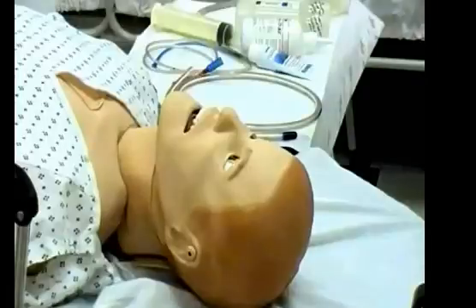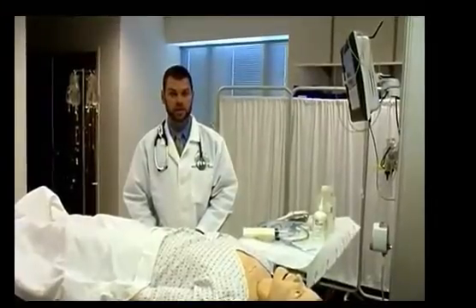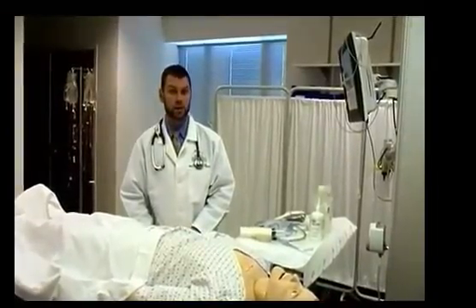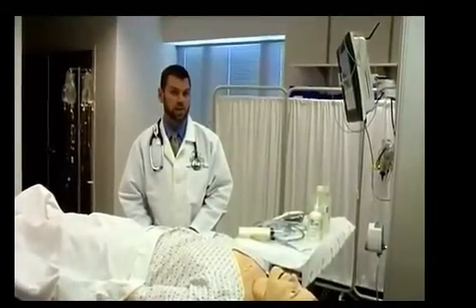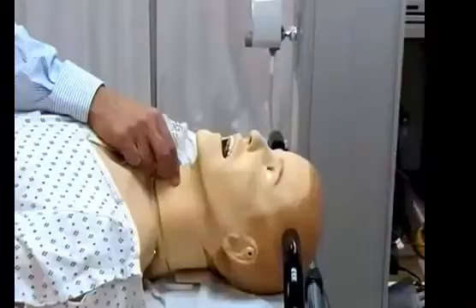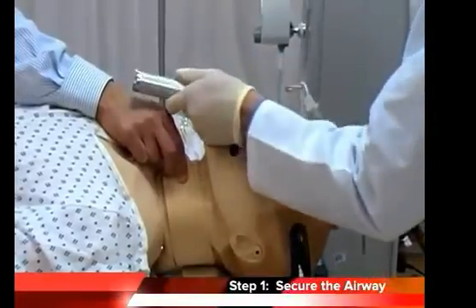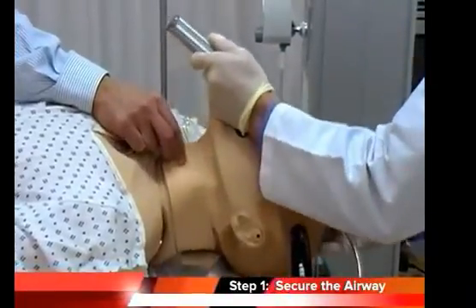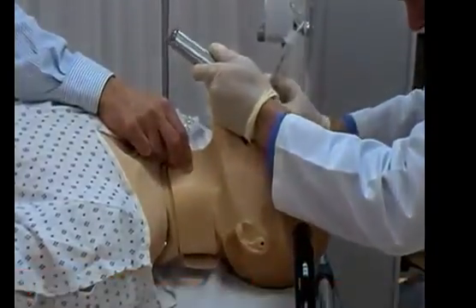Now that we have our equipment ready, meet Stan, our friendly simulation patient. Stan is presenting to the ER after taking a large dose of verapamil in a self-harm attempt. Stan is awake and alert so I don't need to manage his airway, but if he was sedated, or if the drug he took was going to sedate him soon — for example, tricyclic antidepressants — I would go ahead and protect his airway by intubating. Step one: make sure the airway is secure. Aspiration is the most common complication of gastric lavage, so don't use it for sedated patients or patients who have lost their airway reflexes unless you intubate them first.